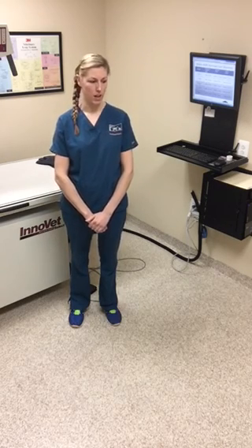So let's say our ideal exposure had a kVp of 76. We would then fill in our chart accordingly. And that is how you would create a technique chart to use for your radiology department.